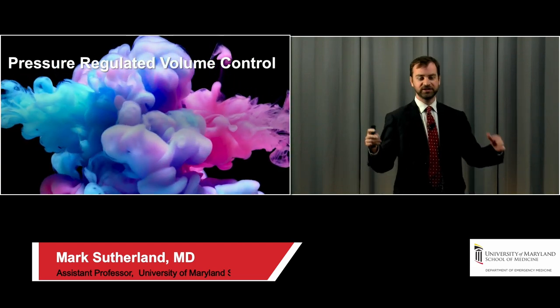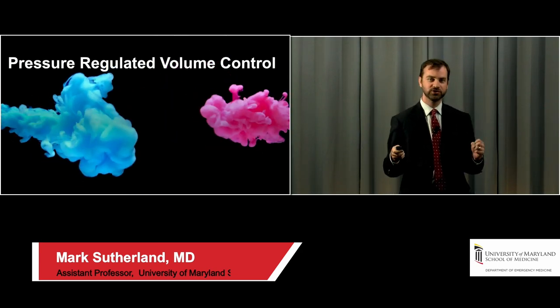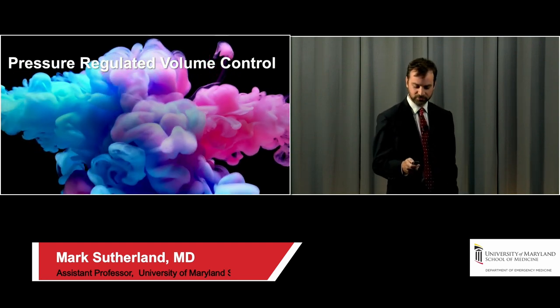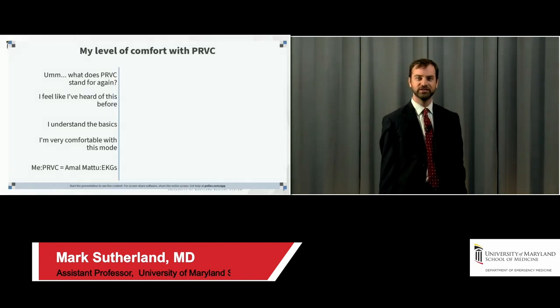But two, PRVC is really a combination of two competing concepts. So it's us trying to take two things that really don't go together and trying to get the best of both worlds, and I would argue at times kind of failing. So I think that animation is actually perfect for PRVC.